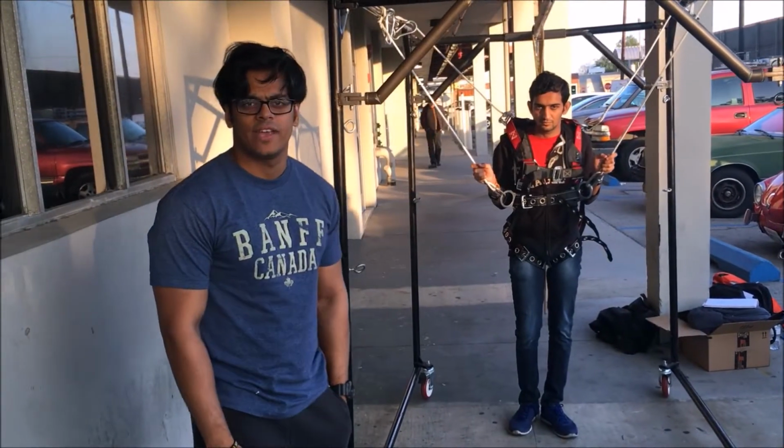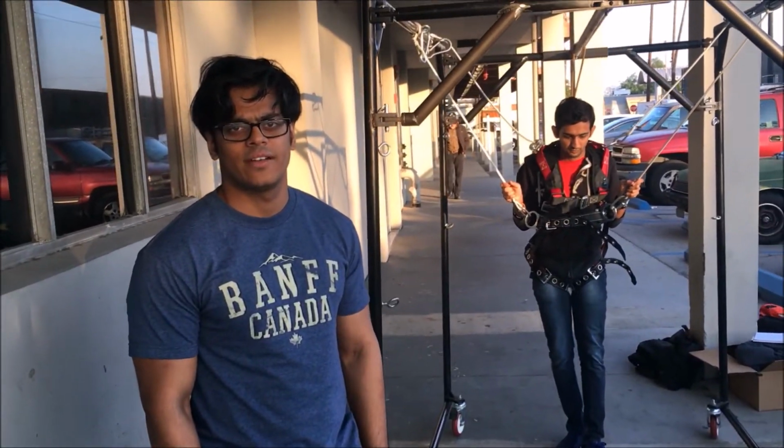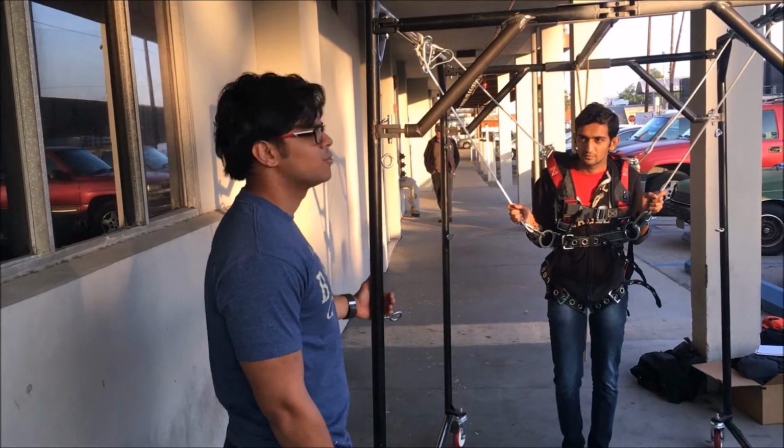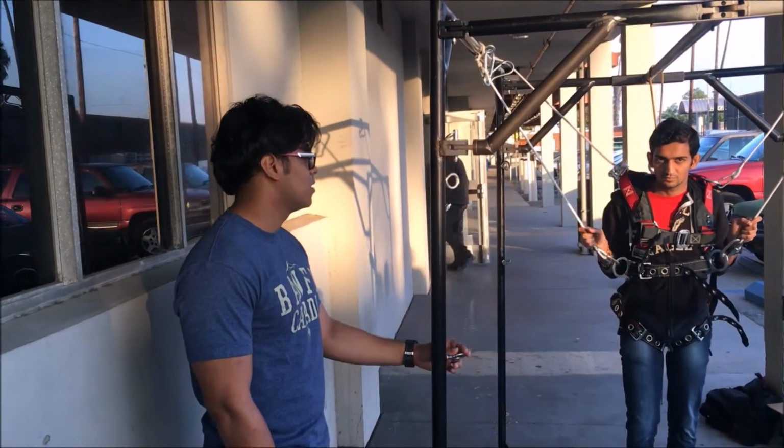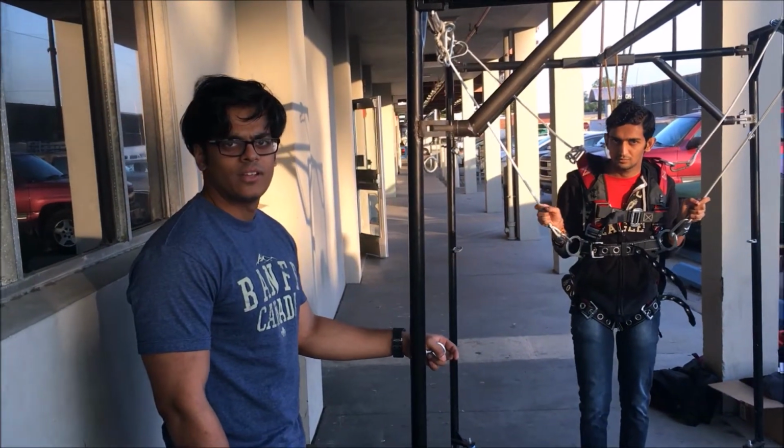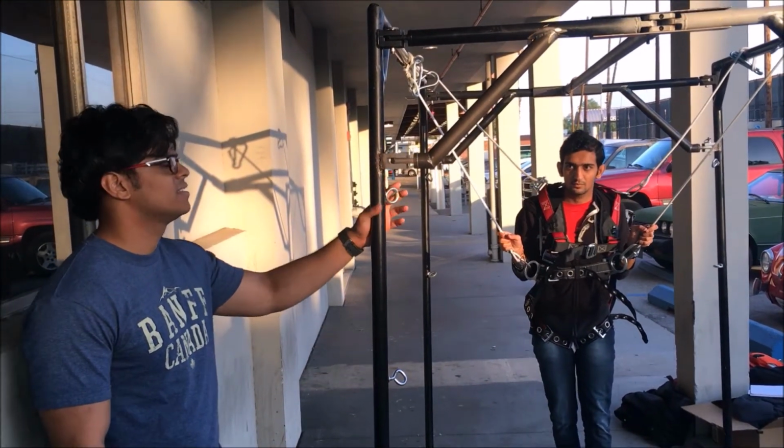So after doing the FE analysis and stress analysis, we can find out that this spider cage can resist up to 250 pounds, and the person here is up to 125 pounds. So he can do the squats, and this can resist more than that.